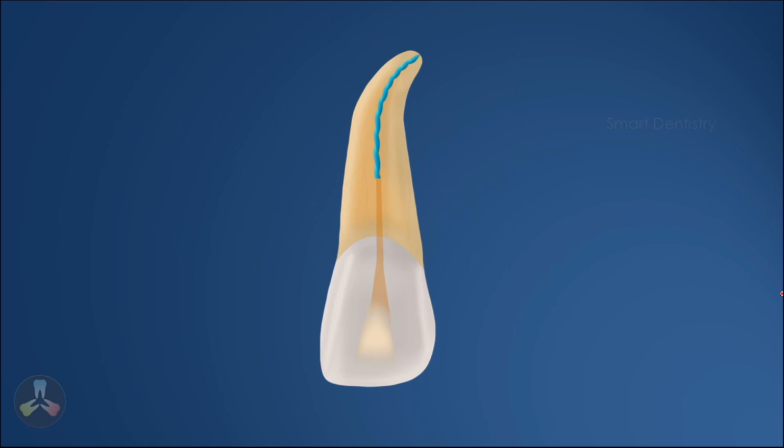The access cavity and the root canal have to be enlarged up to the fractured segment. Then, with the help of a needle burr or a small ultrasonic cutting tip, the tooth surrounding the fractured file segment is removed. After doing this, we can use ultrasonic vibrations, touching the ultrasonic tip to the fractured segment of the file. The file usually will get loosened and it will come out.